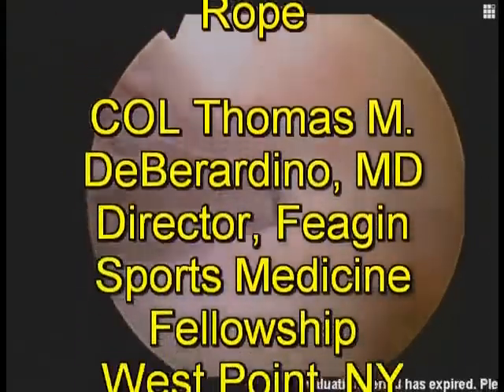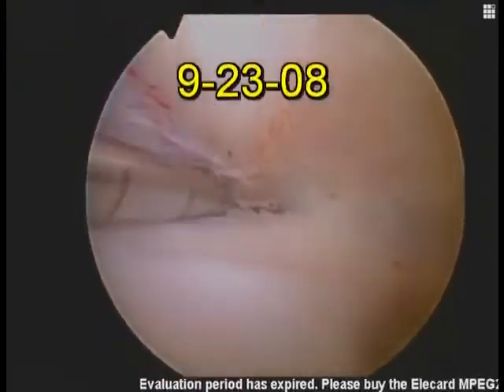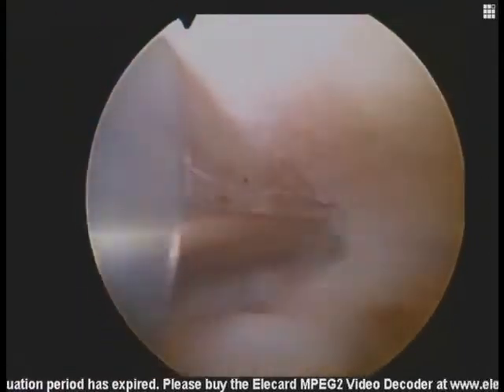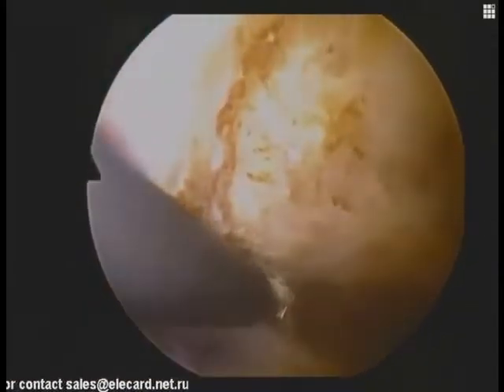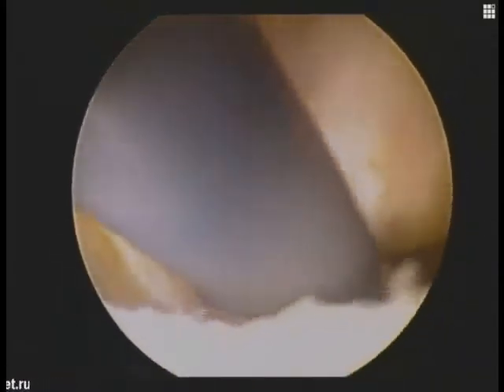Here we are in the left shoulder with a chronic AC separation in the subacromial space, viewed posteriorly with the instrument in the lateral portal, performing a bursectomy and ablation cautery resection device. Debriding under the old AC joint, seen in the distal aspect of the view, with the posterior aspect of the CA ligament above.